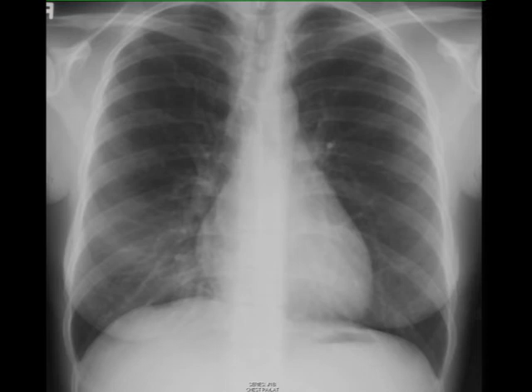On the frontal X-ray it's very, very subtle, but if you compare the right and the left side you'll see a subtle increase in density on the right, in the right lower lung.